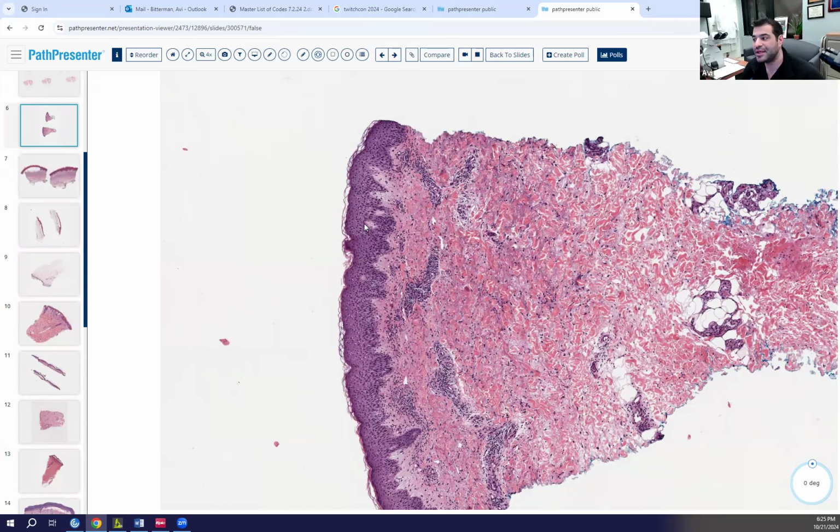And if we did salt split skin, what will we see? I think it's the roof. And what pattern? U or N serrated? N serrated. Good.